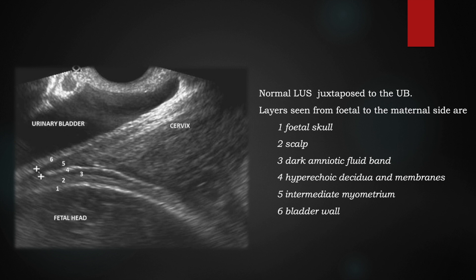When we appreciate the normal anatomy, going from the fetal side to the maternal side: point 1 is the fetal skull, 2 is the scalp, 3 is the amniotic fluid, 4 is the decidua or the membranes, 5 is the myometrium, and 6 is the urinary bladder wall. What we are measuring is the thickness of segment 5, the myometrium.